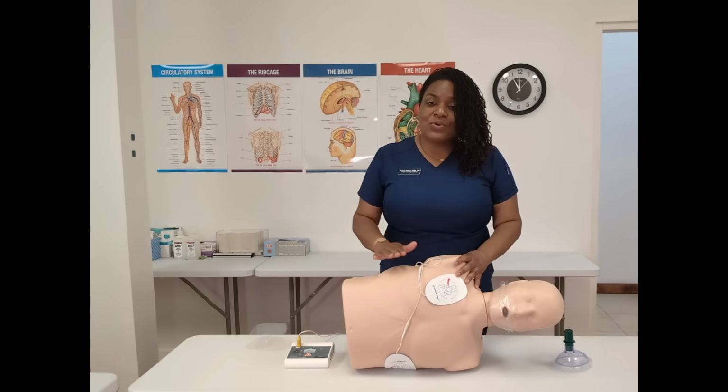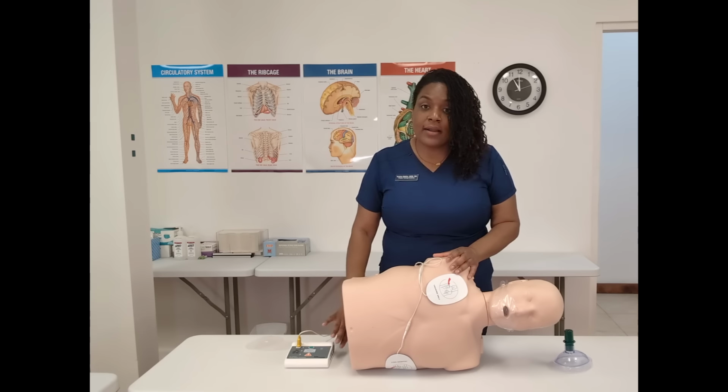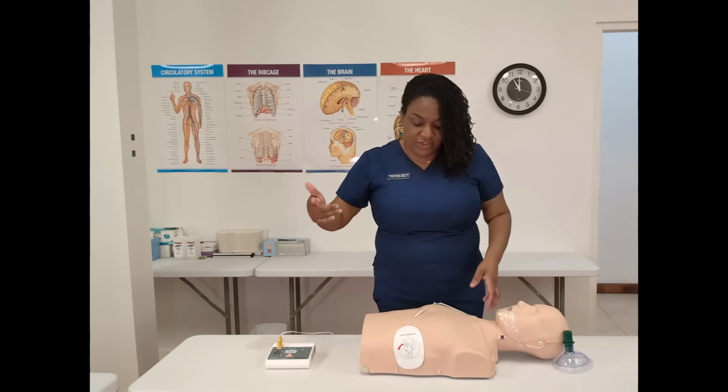And the AED is going to reanalyze every 2 minutes. And if the person does require another shock, you would lay them back down, follow the prompts, and when the prompts have completed, you've pressed the shock button, you go back into your chest compressions.